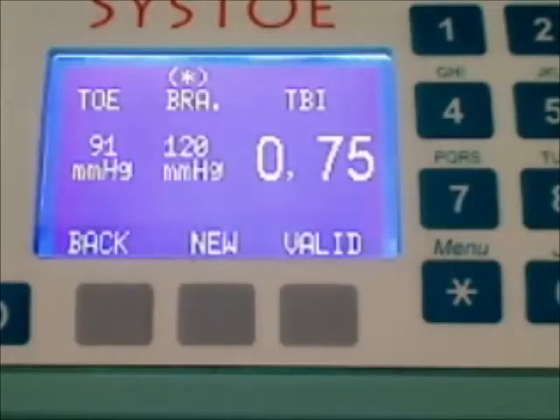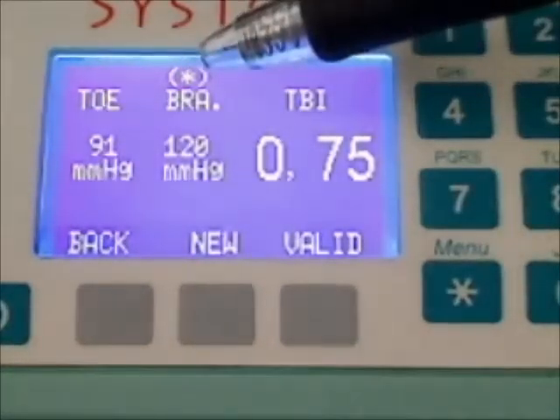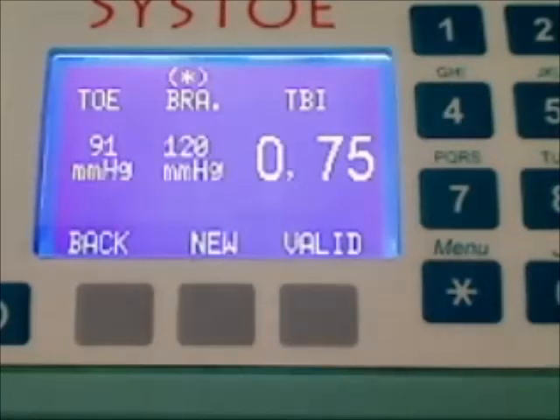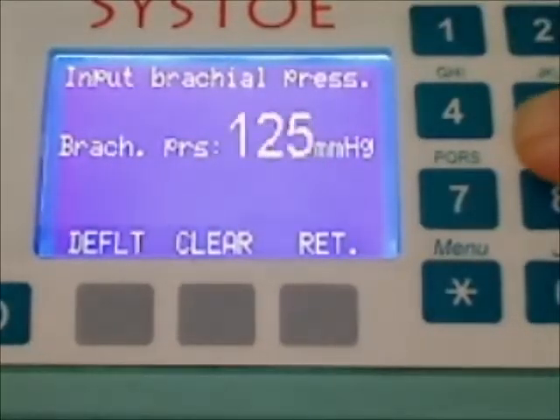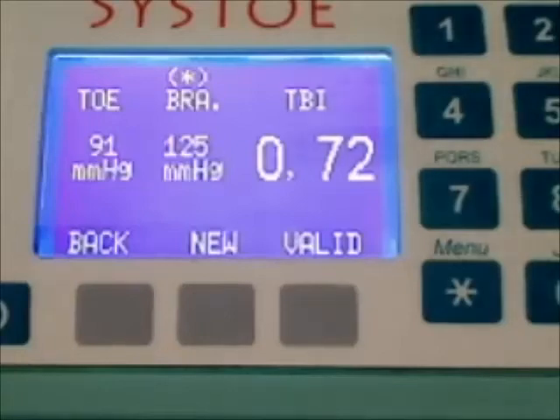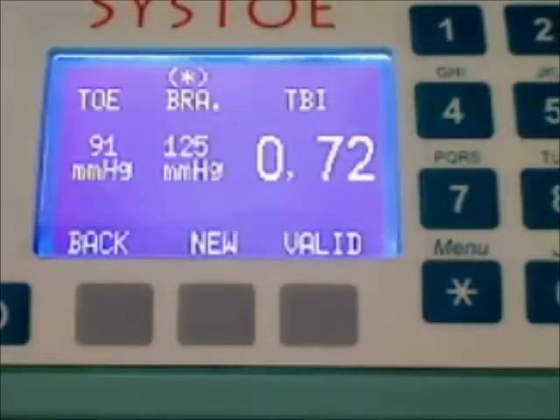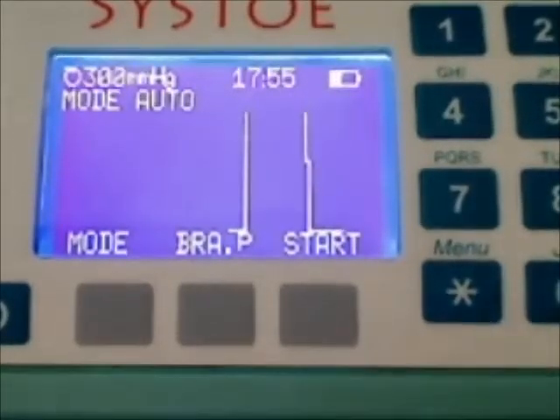If the user needs to input brachial pressure, it is possible from this screen by clicking on the star key. Let's input a new brachial pressure — I click on Start, input 125, then Return. We can see the brachial pressure is updated, as well as the TBI. To do a new measurement, you just have to click on New.